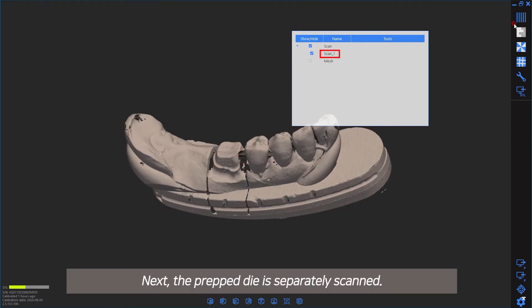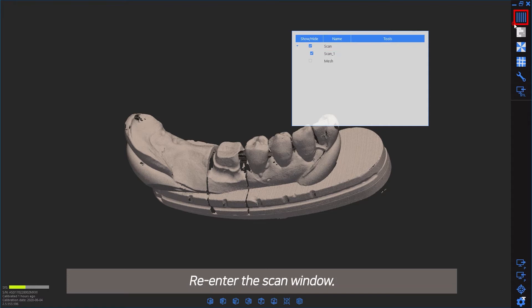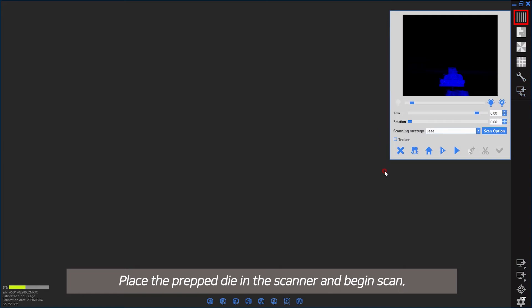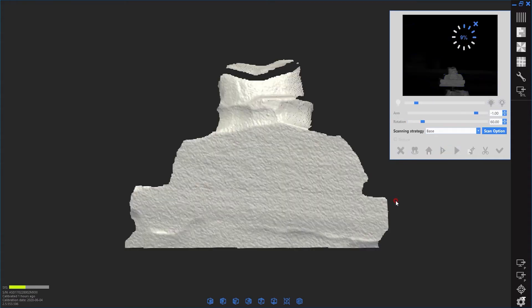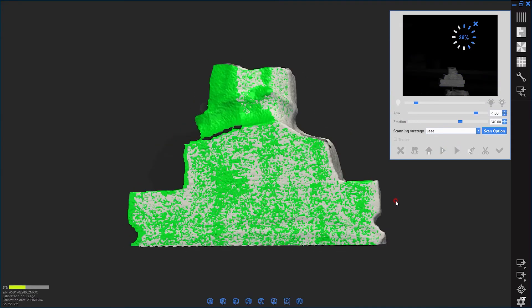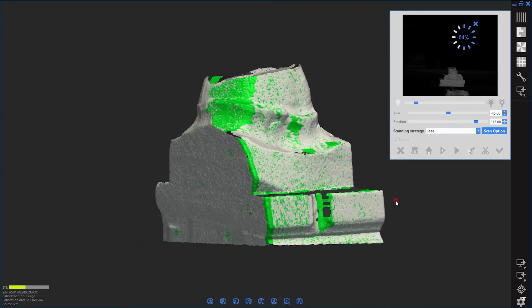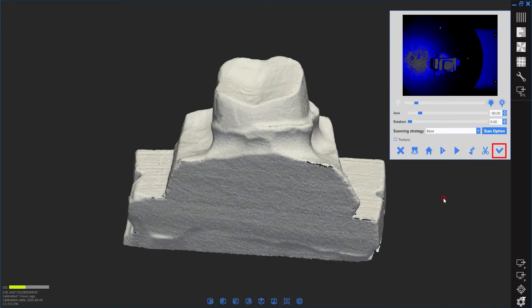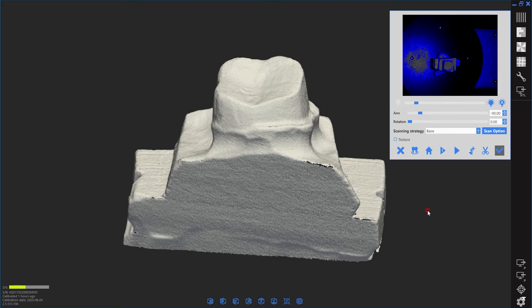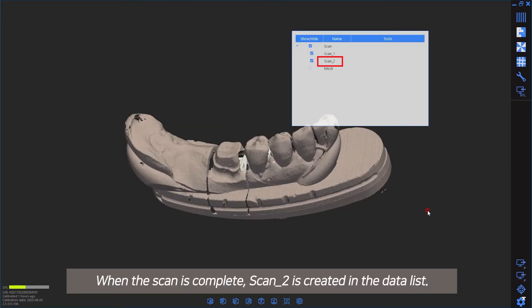Next, the prepped die is scanned separately. Re-enter the scan window. Place the prep die in the scanner and begin scanning. When the scan is complete, Scan2 is created in the data list.